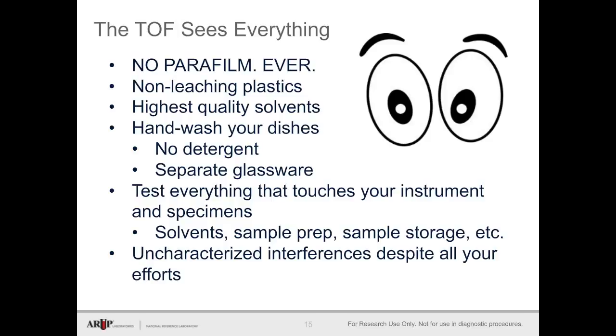Just rinse it with some IPA and methanol to keep it clean. If it's really dirty, a light acid wash followed by a thorough rinsing with IPA and methanol will clean things back up again.